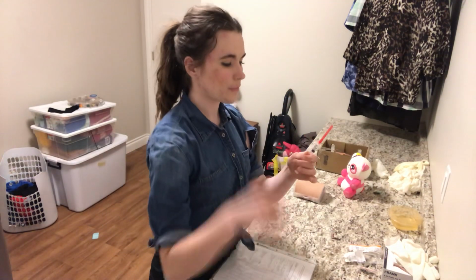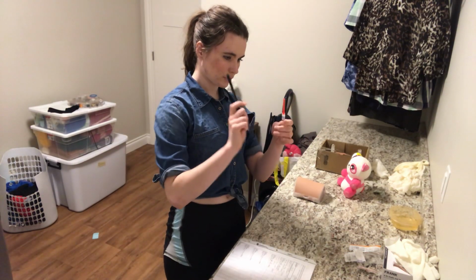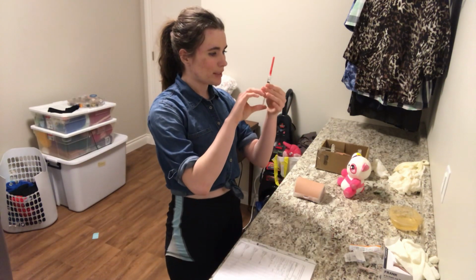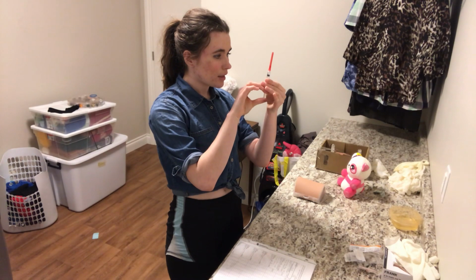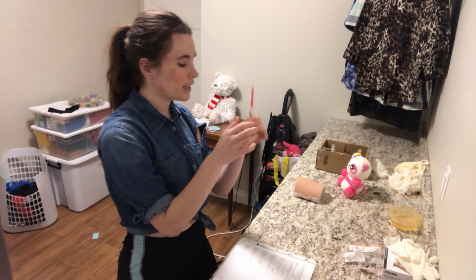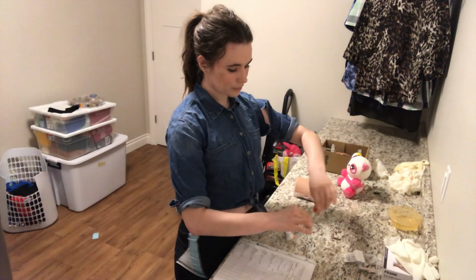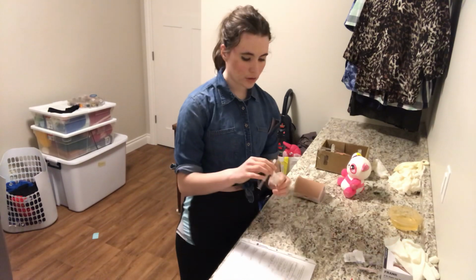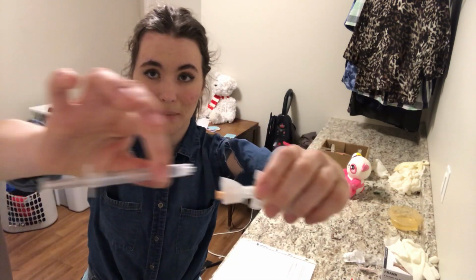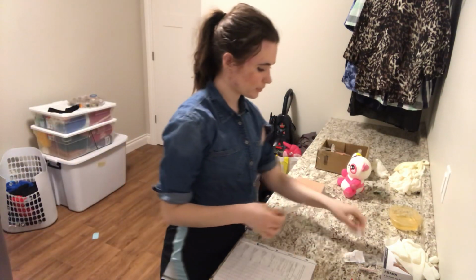So now I'm going to pull back, get rid of bubbles, okay, and just doing that without contaminating the plunger. I'm going to recalibrate, and I see that we still have just a little bit more than 1/2 ml, so I'm going to withdraw again. And I'm going to detach my blunt fill needle, and I'm going to attach my safety glide needle, and so I'm going to attach it without contaminating the hubs and without contaminating the plunger. Just connect on like so.